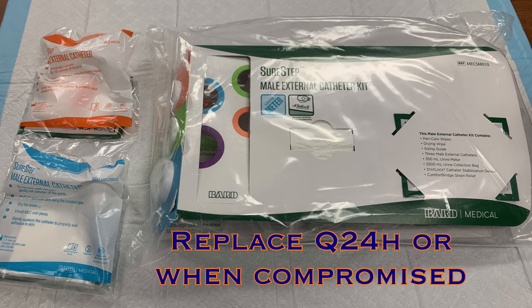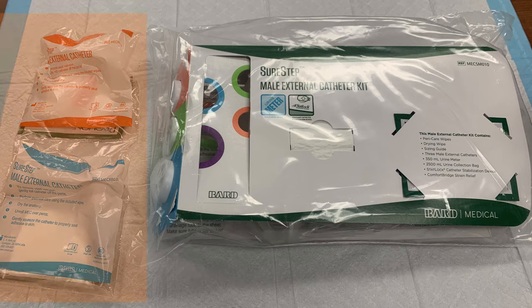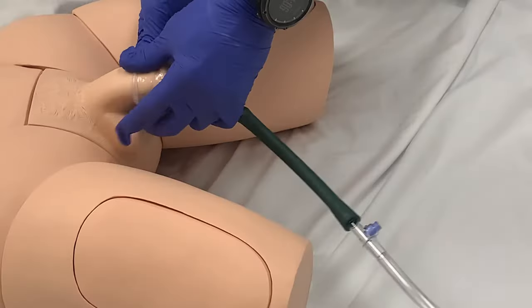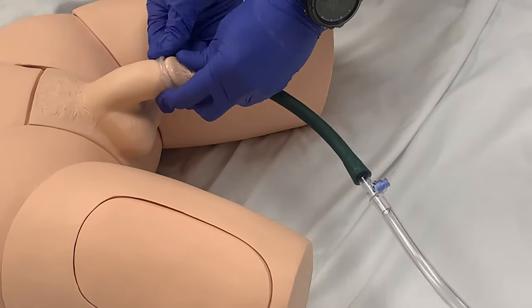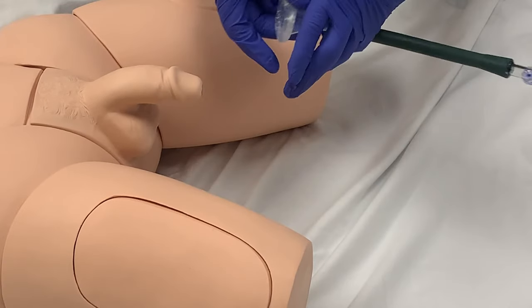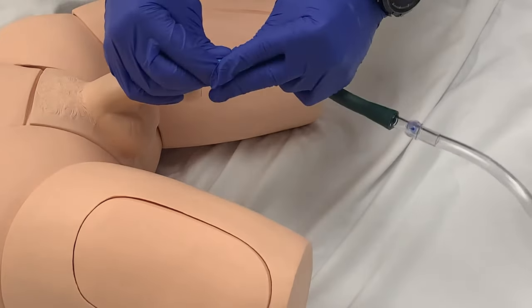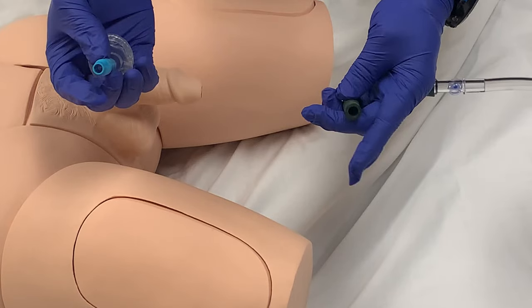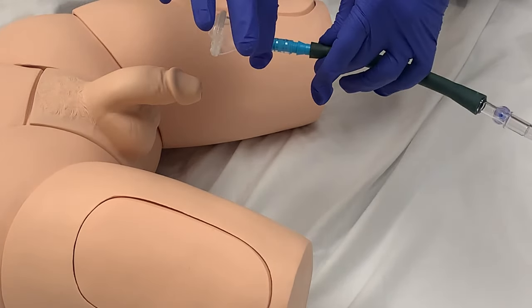At least every 24 hours the condom catheter must be replaced. Also replace the catheter if it is ever damaged or is no longer adhering to the patient. Obtain a replacement catheter from the pod room. The bags for the replacement catheters are color-coded for easy identification, so if your patient has a blue spout on their existing catheter, you will need a replacement catheter packaged in blue. Remove the existing catheter by gently rolling it off the penis. A nice feature of this device is that the adhesive leaves little to no sticky residue on the patient, which is a significant upgrade from previous products. If you are replacing the catheter, remove the condom from the Comfort Bridge tubing. The drainage tube and bag will continue to be used — you will only be replacing the condom, so attach the new condom to the tubing and reapply to the patient.